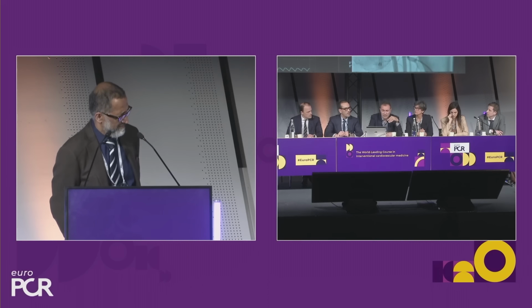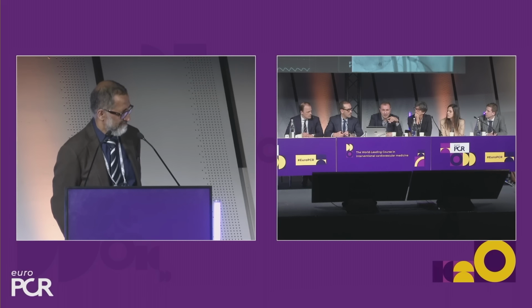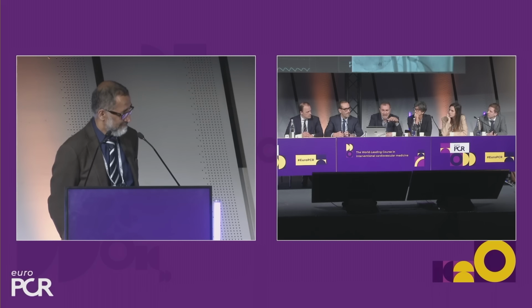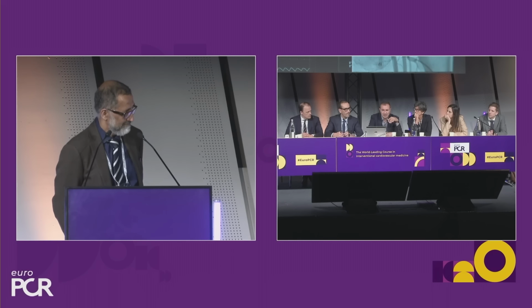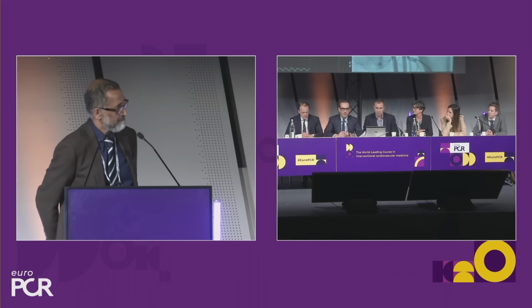Yeah, so I mean, the annulus is 18 by 24, and the current recommendation from Abbott is to use a larger balloon, probably the average of those two measurements. So we would be saying 20. I mean, I appreciate your comments, and I agree that it's not heavily calcified. But just to make that point, that perhaps a more aggressive balloon valvuloplasty might have been recommended. But I'm sure it's going to be fine in this case, to be honest. Yeah, that was my point. Maybe it's something we need to discuss a little bit.